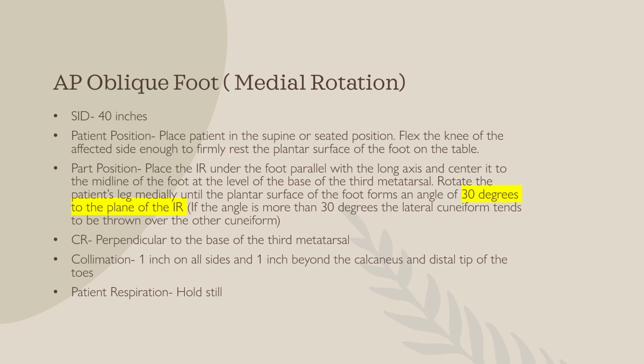Rotate the patient's leg medially till the plantar surface of the foot forms an angle of 30 degrees to the plane of the IR. If the angle is more than 30, the lateral cuneiform tends to be thrown over the others. The CR perpendicular to the base of the third metatarsal. Collimation 1 inch on all sides and 1 inch beyond the calcaneus and distal tip of the toes. And hold still.